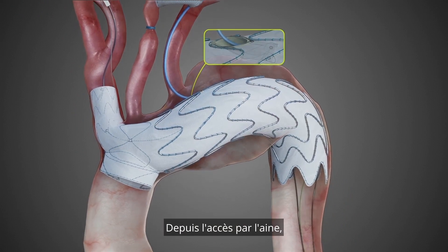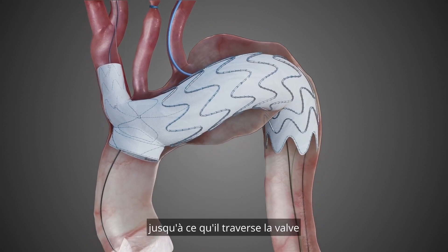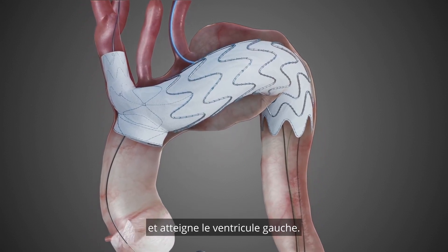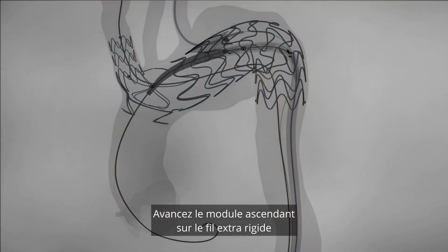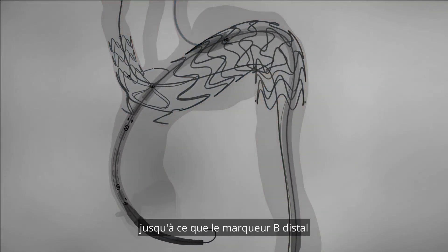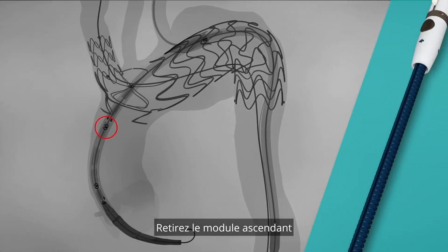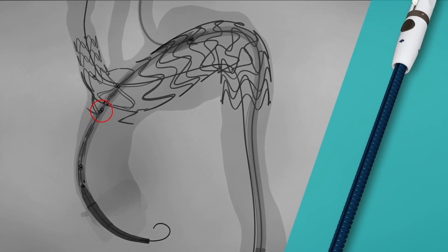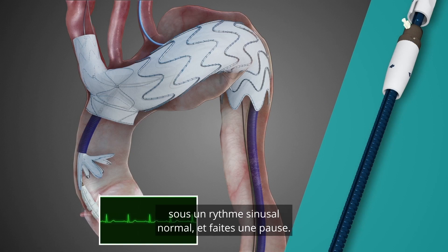From the groin access, introduce an extra stiff double curved wire until it crosses the valve and reaches the left ventricle. Advance the ascending module over the extra stiff wire until the distal B marker passes the dock ring. Pull back the ascending module to align the B marker with the dock ring. Pin the handle and rotate to deploy the first stent under normal sinus rhythm and pause.